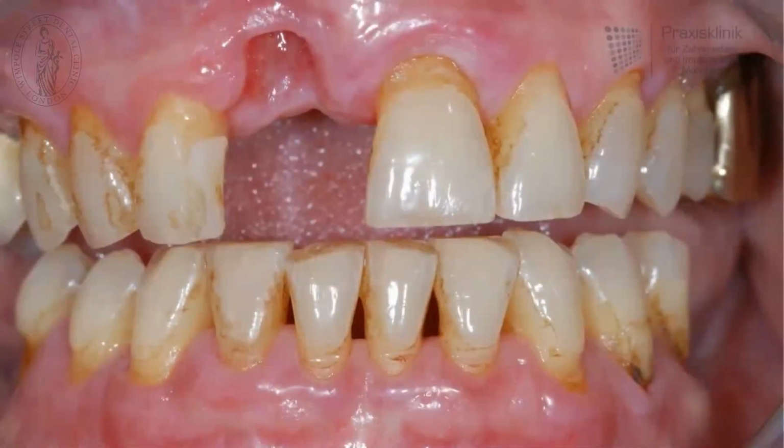The patient in this case is an older patient. As we can see, there are a lot of stains on the teeth, we have grinded teeth, and we have a missing incisor. Before it was extracted, the missing tooth had a long history of different severe problems, leading to an intense inflammatory process around the root, and as a result we have an intense loss of bone and soft tissue in the area where the tooth was extracted.